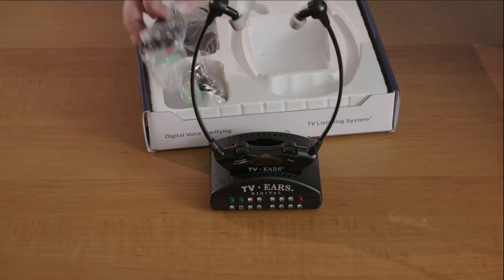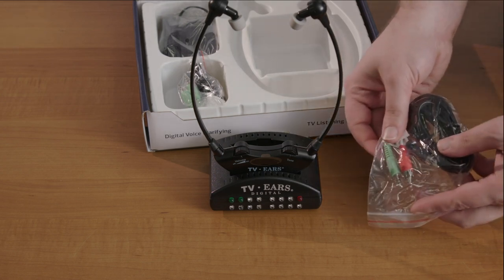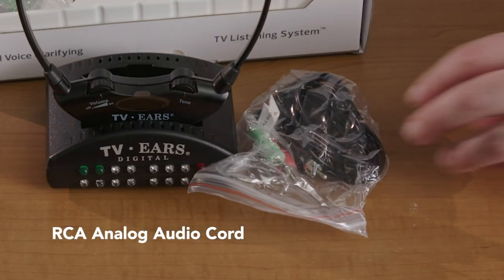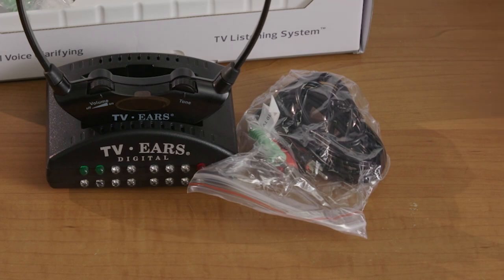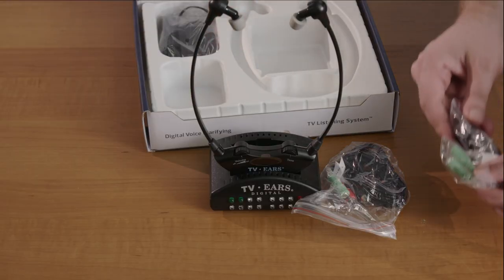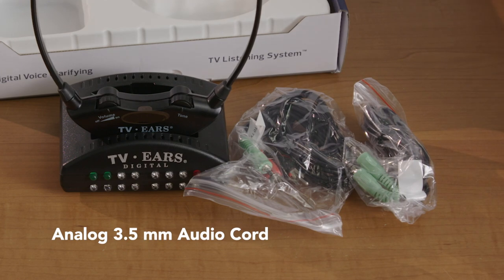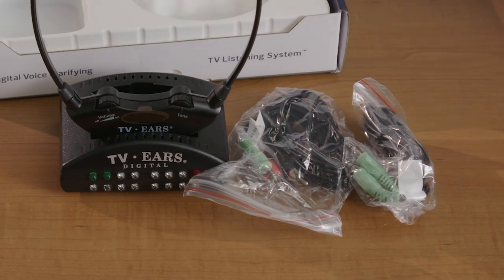We have several different ways we can hook it up. First, we have this cord with red and black plugs — this is our RCA analog audio cord, used to hook up to the TV into a spot labeled audio out with two round holes. This one here with two green plugs is our analog 3.5 millimeter audio cord, used to hook up to a TV that has an audio out that is a single hole.